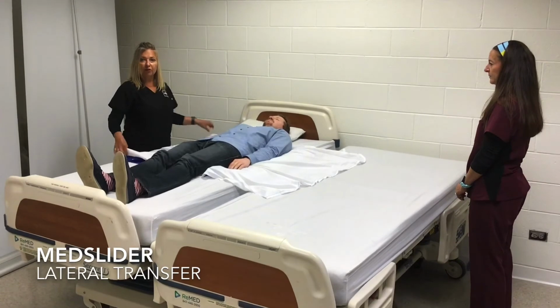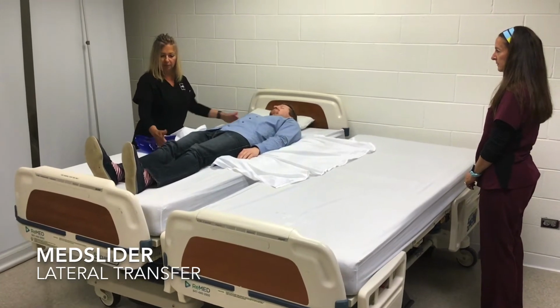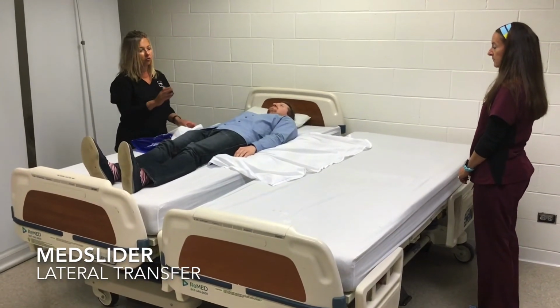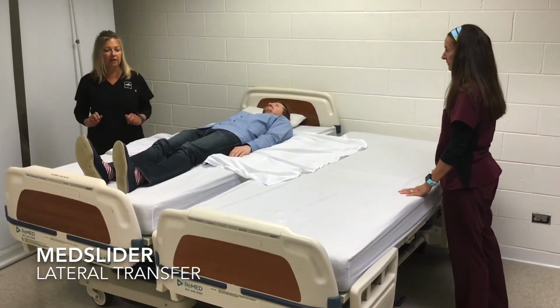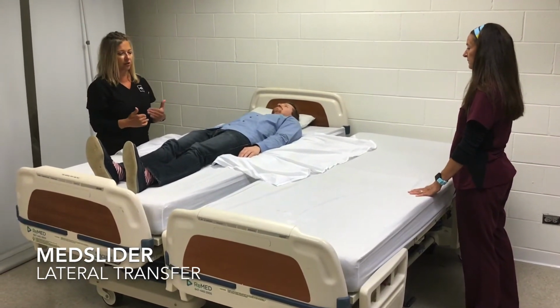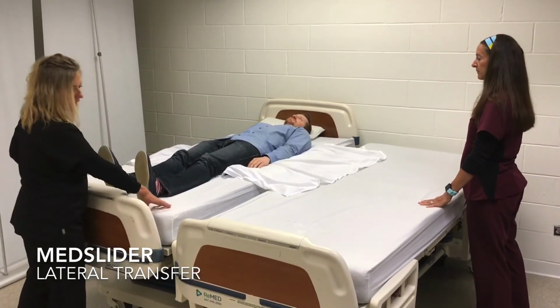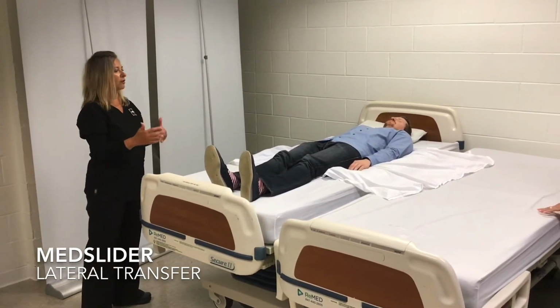So a couple of things we want you to note. The MedSlider is placed under the patient between his shoulders and hips. And again, the directional arrows are pointing across to the direction we're going to slide the patient to the other surface. Some safety features that we like to point out, or tips. One is that we want the aid of gravity to help us transfer the patient to the other surface. So this second bed is approximately 1/2 inch to 1 inch lower than the bed the patient is on. The other safety feature is that you always want to lock the casters, of course, on both the surfaces.